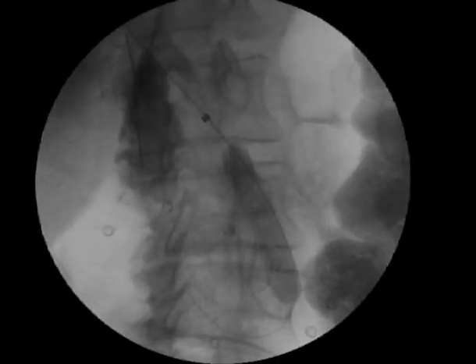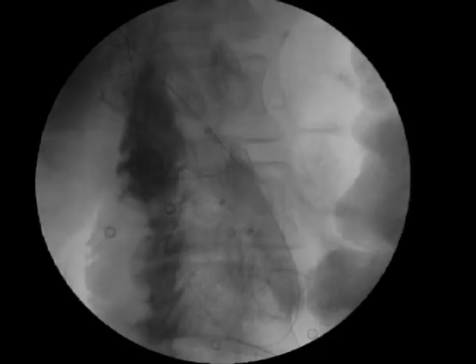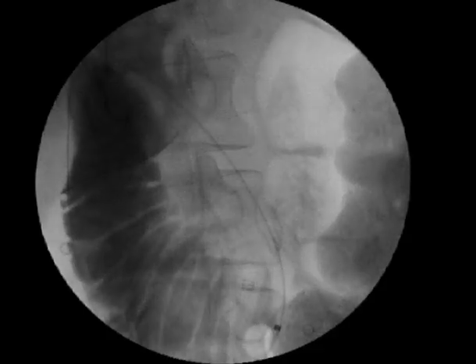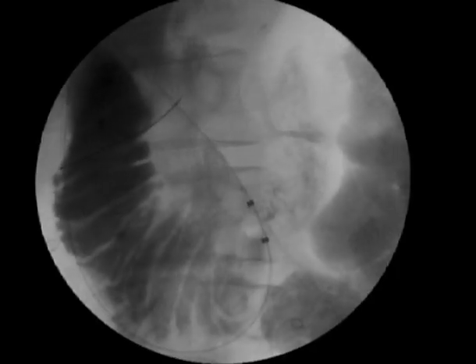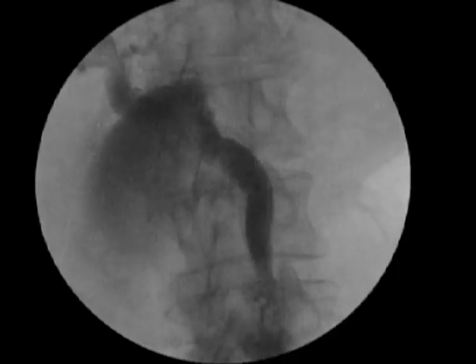Anterograde sphincteroplasty is performed using a 10, 11, 12 mm CRE balloon. An extraction balloon is used to perform delicate sweep movements to push the stone across the papilla into the duodenum. Final cholangiogram reveals successful stone removal.